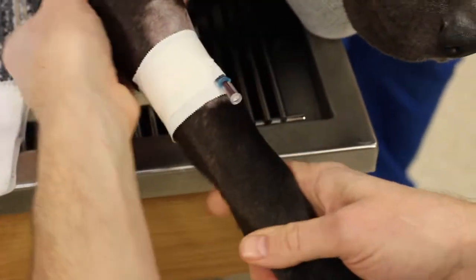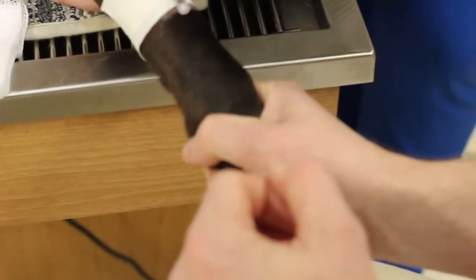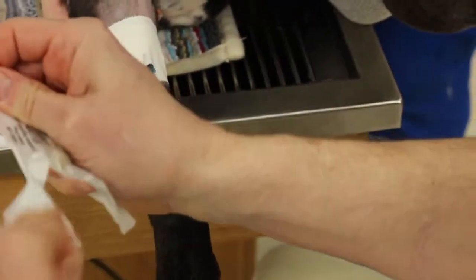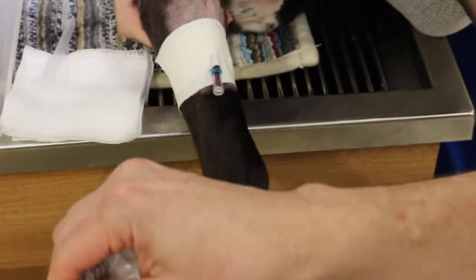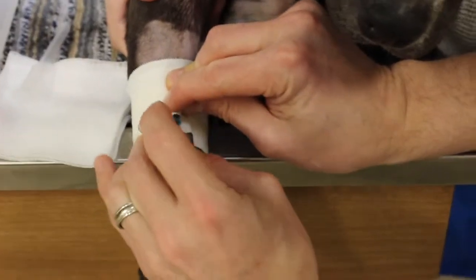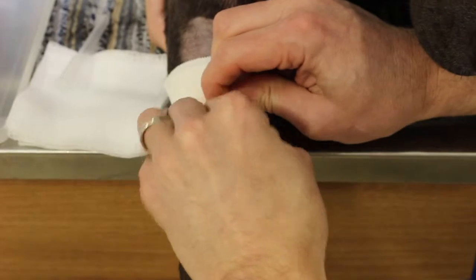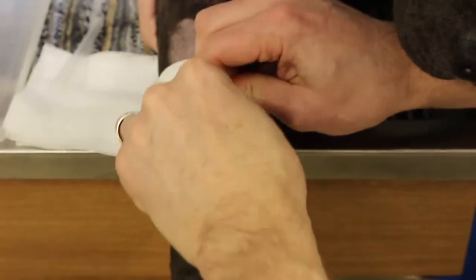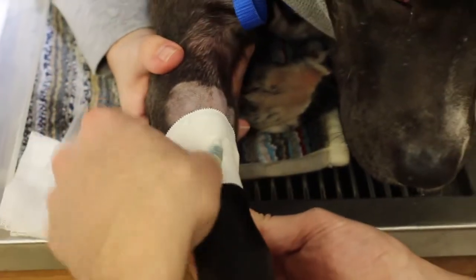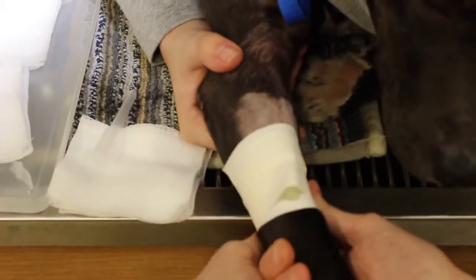Until I get that catheter fully secured, a lot of times I'm paranoid — I hold it with this hand so she doesn't pull back and jerk it out. But if you have your assistant holding her, you can take your hands off and use both hands. In this case I'm just putting a catheter cap, so I'll try to occlude the catheter a little bit to keep it from being messy. I put this cap on and I've left myself enough room for the threads to screw on. I screw it on nice and tight because I don't want it to come out or leak. Basically make it a permanent attachment. Then I like to cover the haired portion of the skin and put another piece of tape over here for insurance.